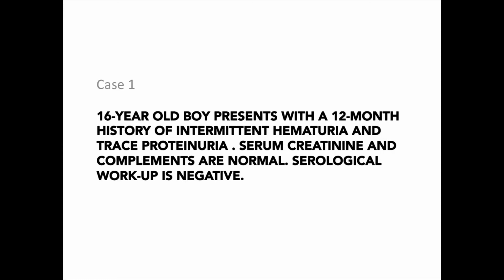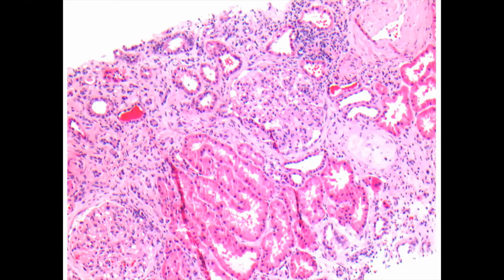All right. Complements ليش مهمة؟ complements مهمة على أساس إن إحنا we're thinking about post-infectious, we're thinking about lupus, okay? The serological workup is negative. Serological workup اللي هو ANA وANCA وanti-GBM هذين كلهم serological workup, and in this case it was negative. Okay. خلينا نطالع اللايت مايكروسكوبي.